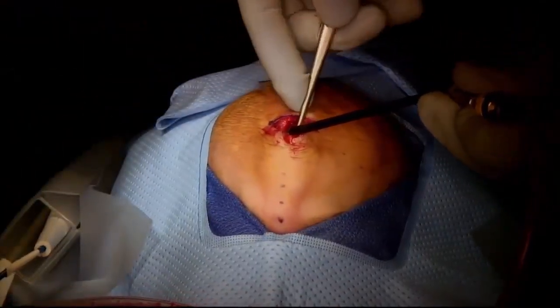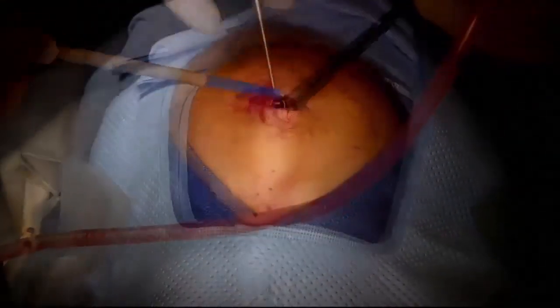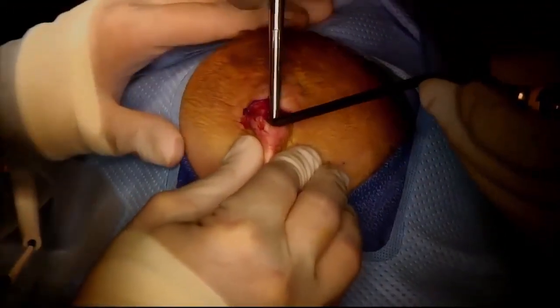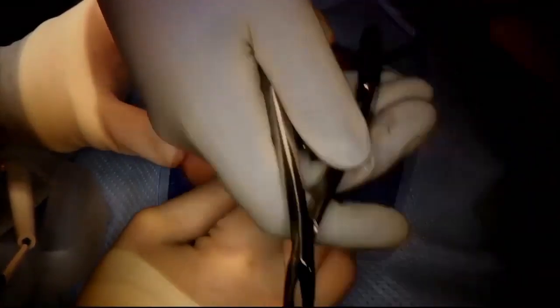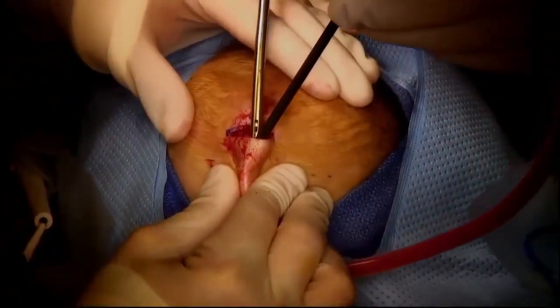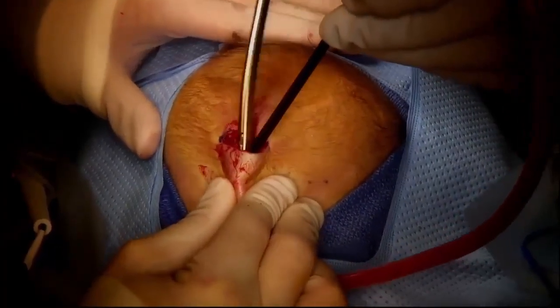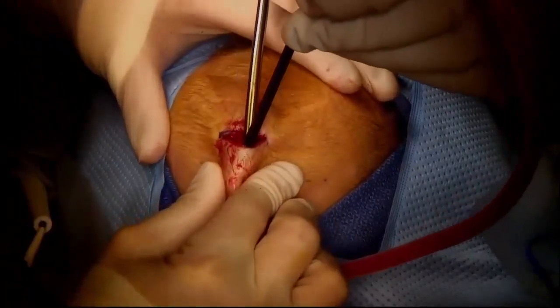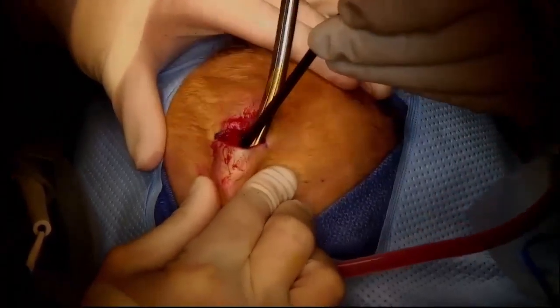Once again, the number 1 Penfield dissector is placed under the bone and advanced towards the mid-forehead. The osteotomy can now be made in a piecemeal fashion using either Leksell rongeurs or bone cutting rongeurs as demonstrated here. The osteotomy slowly advances in a piecemeal fashion to reach the mid-forehead.